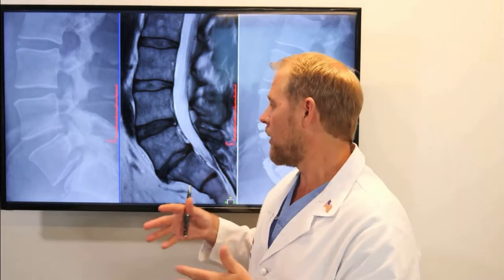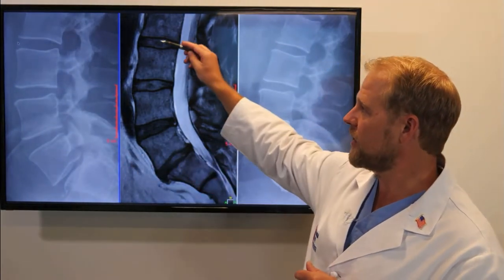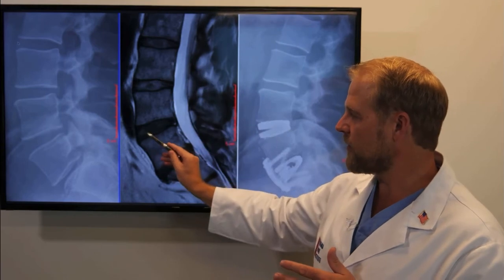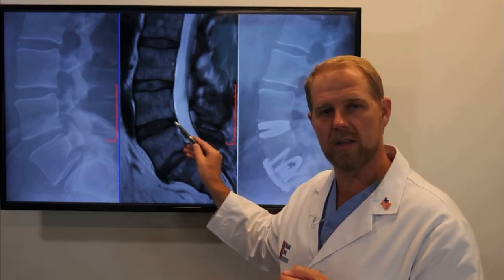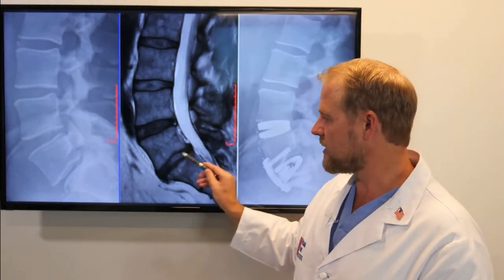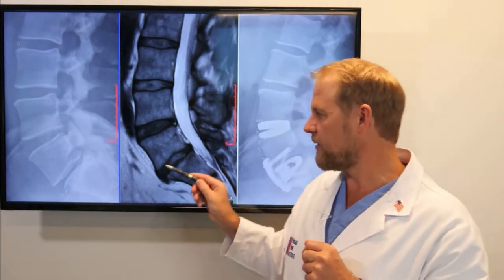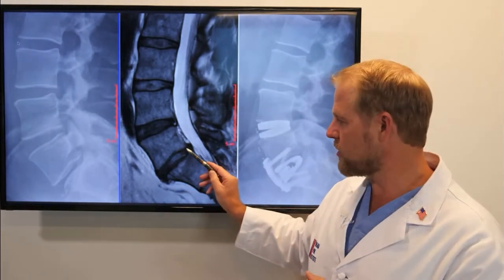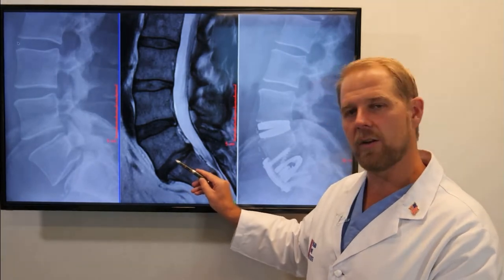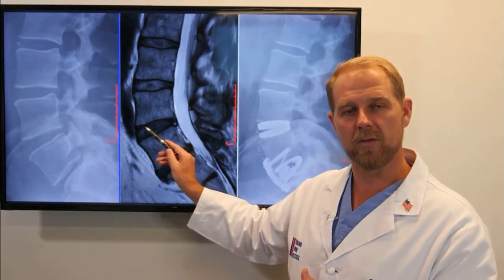Now we see the MRI of the same patient. We have normal discs here and here, but as we get to the L4-5 disc, we can see it's starting to generate a tear in the disc — unfortunately causing some back pain. And then the L5-S1 disc is much further gone, with pinching of the nerves at that level. Our hybrid surgery is to remove and do a minimally invasive fusion at the L5-S1 disc, and then to do a lumbar disc replacement at L4-5.